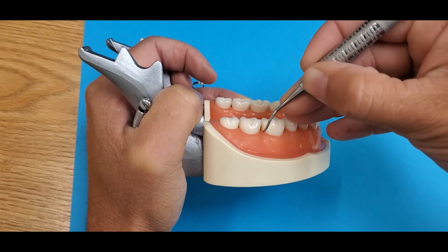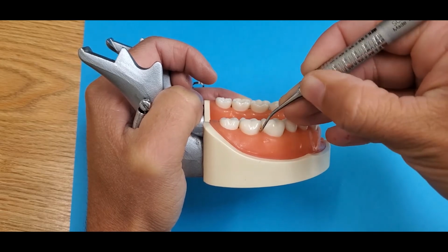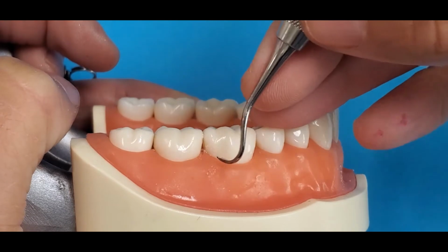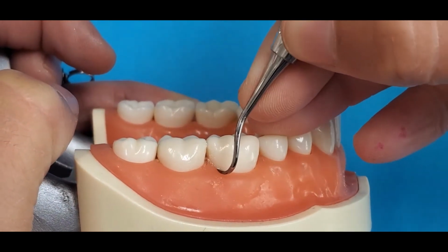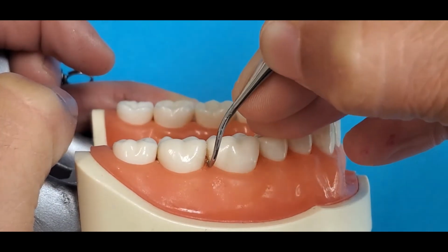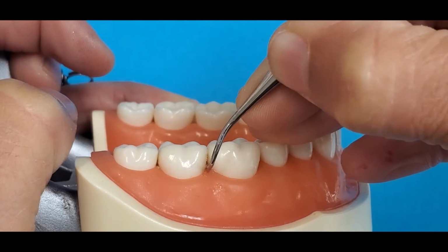short biting strokes, working into the distal surface. Again, your insertion point, distal line angle. You're using wrist motion, moderate to firm lateral pressure.